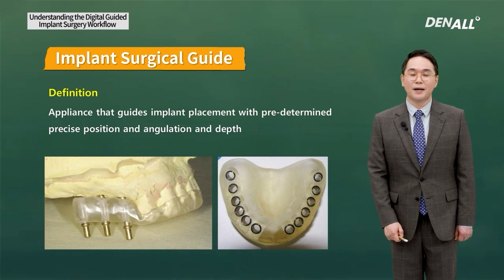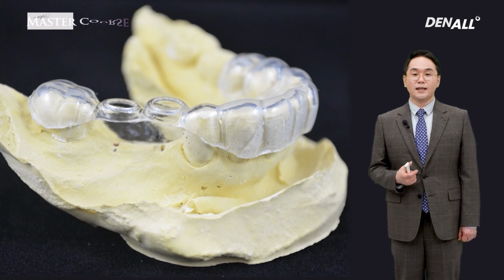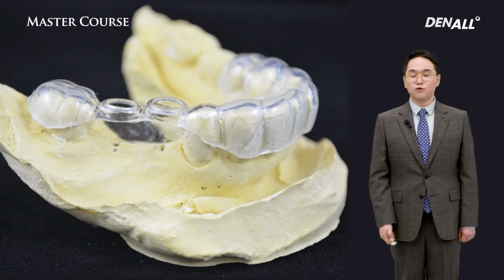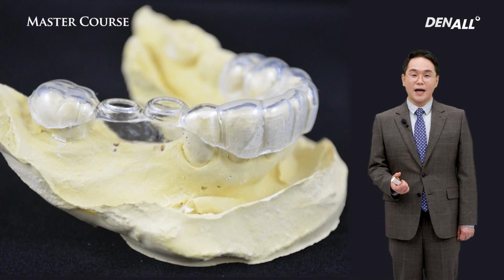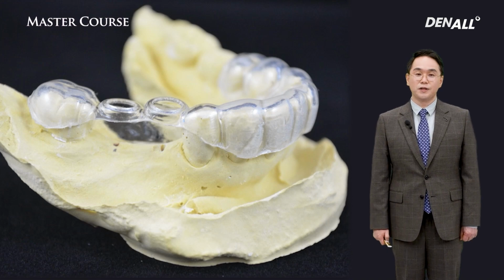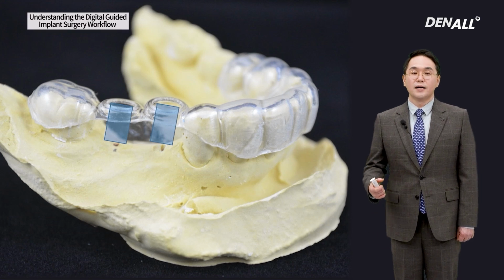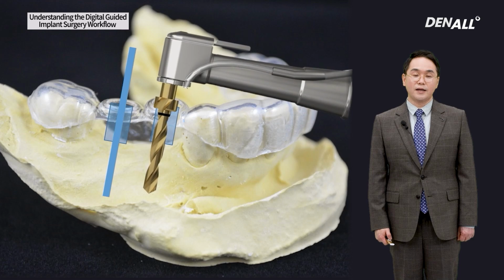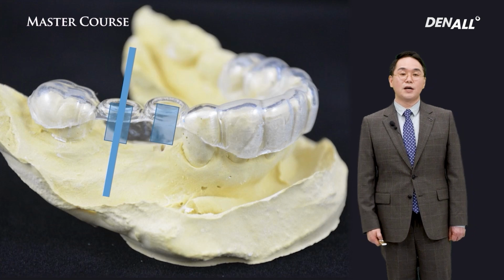The holes are designed for ideal positions, but with the analog style conventional surgical guide, there are no dedicated drilling tools. In other words, there are no dedicated tools to induce accurate drilling through the holes, so conventional drills would be used, but the size of the guide hole would be bigger than the first twist drill, which is 2.0. So during drilling, ideal angulation cannot be controlled.